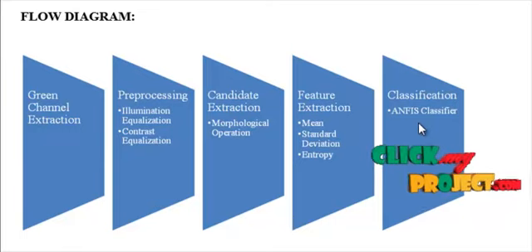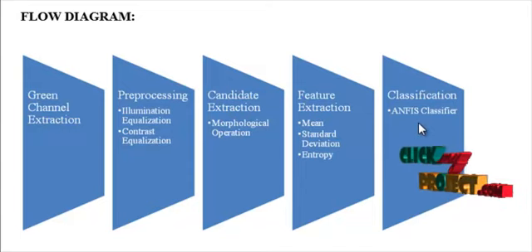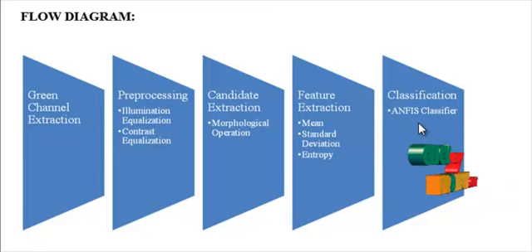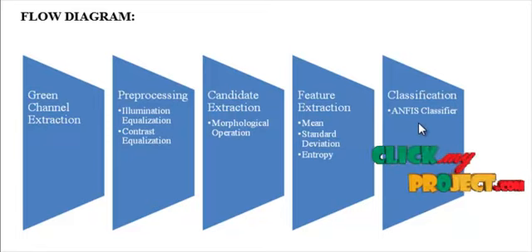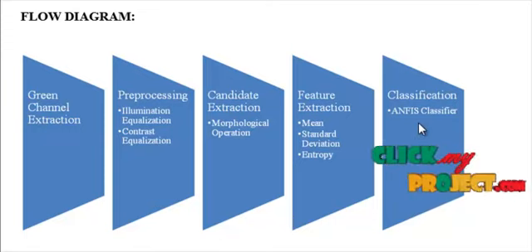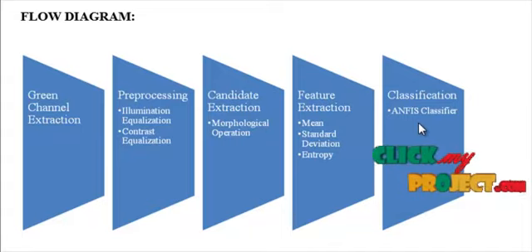After that, the classification process is employed, which is based on the ANFIS classifier. The ANFIS classifier classifies the input images and identifies the defects in the images. The classifier is a combination of a neural network and a fuzzy logic process. The performance of the process is measured in terms of the accuracy of the process.